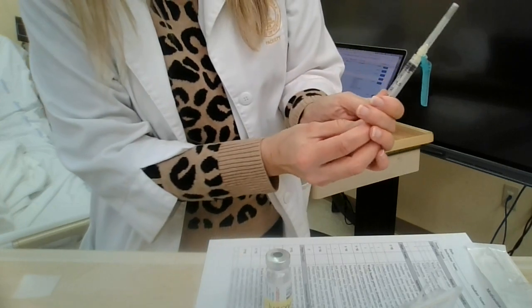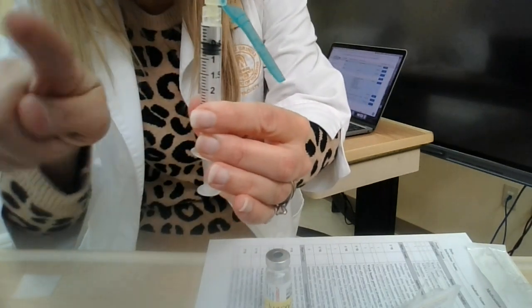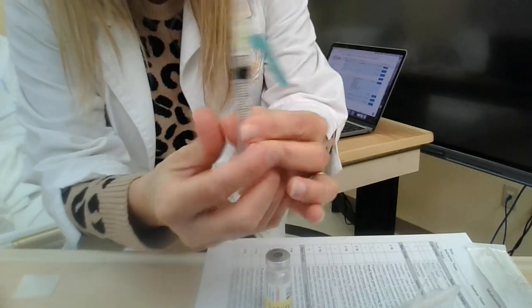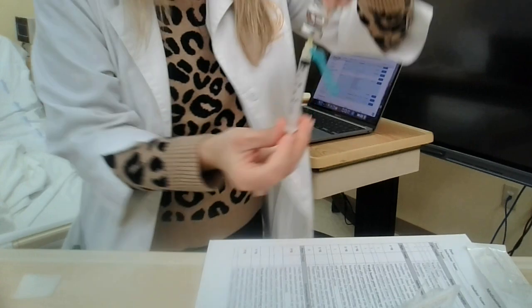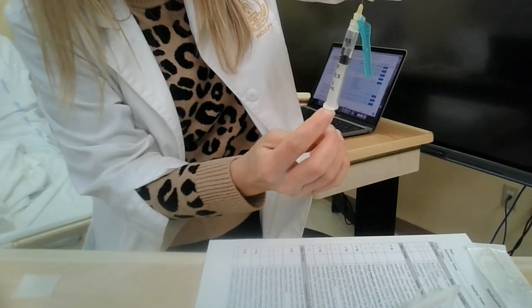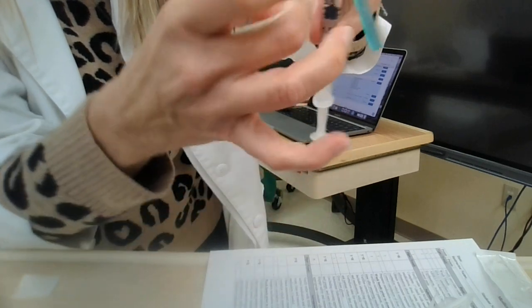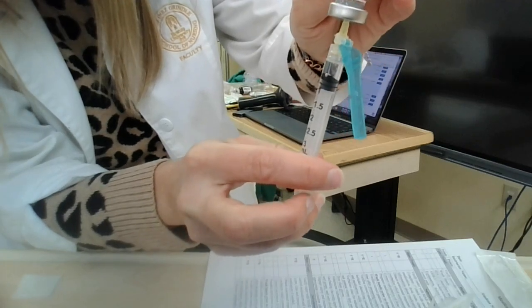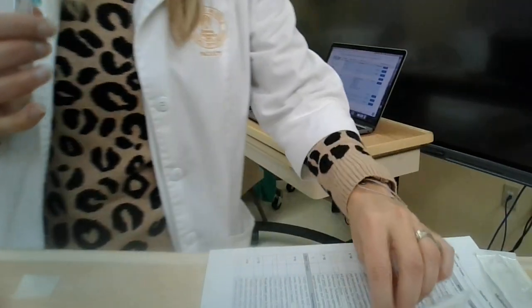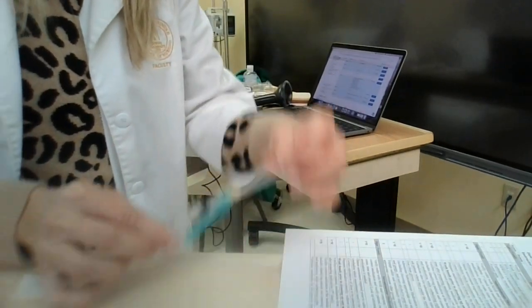Same thing with the insulin. I'm going to pull up in air what I'm taking out in volume. You can kind of see this syringe, it's kind of like a little mountain. The base of the mountain is where you should have your dose in the air. So I'm going to go ahead while it's down, inject my air, invert it, and I'm going to go ahead and pull up what I need. And same thing, I can draw back a little bit more than what I need because you can see in there I've got a little air bubble. So then, holding it, I'm going to flick the air bubbles back to the top, and then I'm going to go ahead and push so that I'm at 0.5. Okay? Again, using the scoop method, I can go ahead and, there we go, to keep that clean.